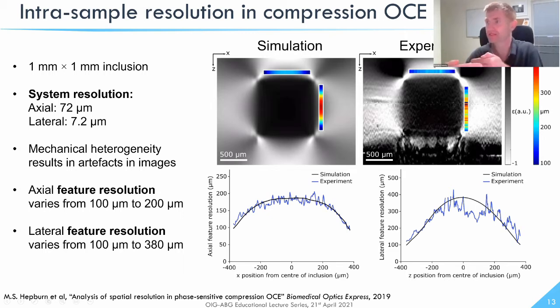So when you compress the silicone, in order for it to deform axially, it needs to expand laterally because of its incompressibility. The Poisson's ratio is close to 0.5, but the fact that it's physically bound to the stiffer material limits the ability for that to happen until you get to the boundaries of the inclusion, at which point the softer material is now expanding into unrestrained softer silicone, and so you have this sharper transition between the two regions.